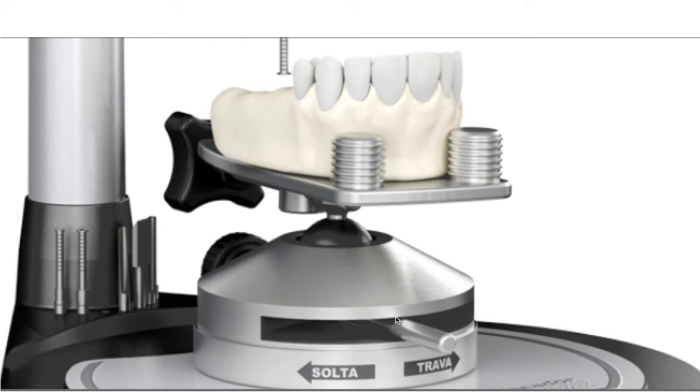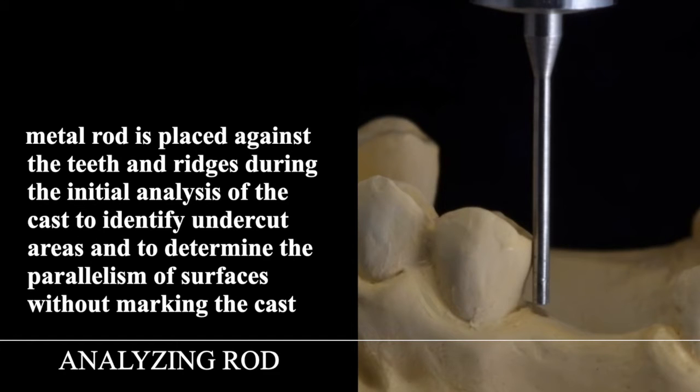This surveyor table has an open-close lock latch to allow you to have a ball attachment roll around it so that you could place the cast in many different positions. The analyzing rod is the metal rod placed against the teeth or the ridges during the initial analysis of the cast to identify the undercut area and to determine the parallelism of surfaces without marking the cast. Here you're looking at the distal portion of the tooth, which is one of the abutments, and you can see there's an undercut amount below the analyzing rod. You need to make this area equally distributed between the anterior and posterior abutments present.